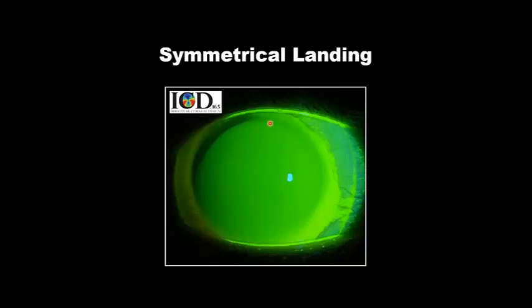That traps the fluid in the center, and that's what helps us in the ocular surface disease environment, where we have all this fluid trapped in there, this bath for the ocular anatomy. The central epithelial tissue is bathed in this fluid as long as the patient has the lens on, and that's why there's such relief from scleral lenses.